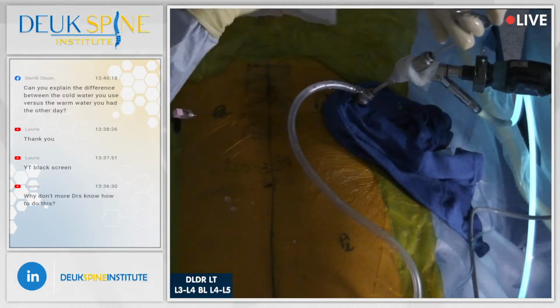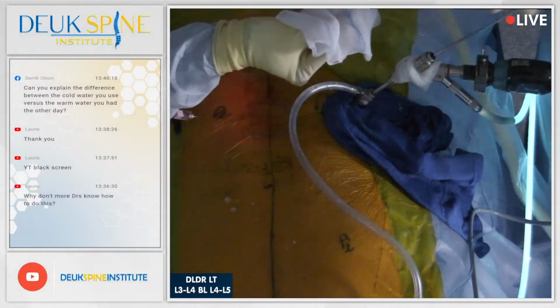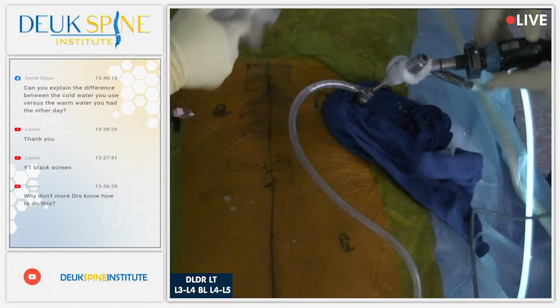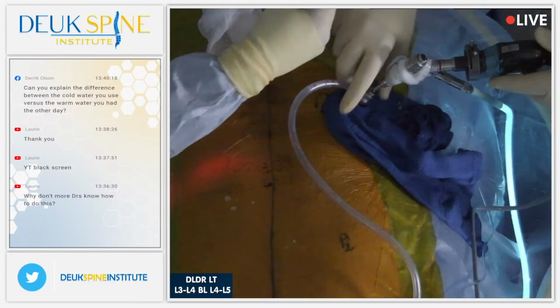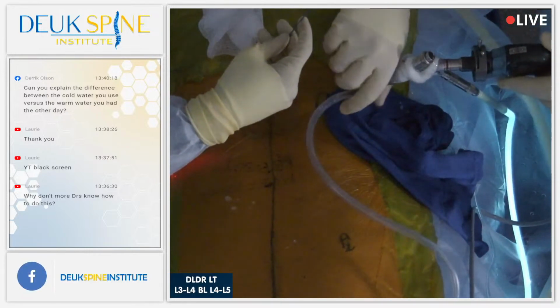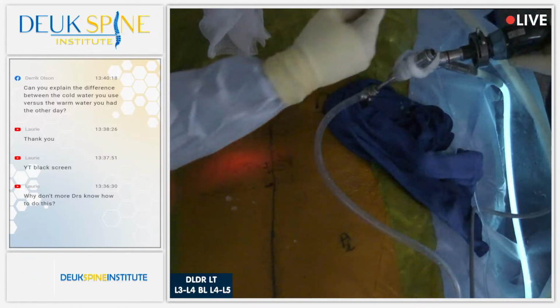If you don't do fusions and artificial discs, you're not considered sexy. You're not considered cutting edge. You're not considered a top surgeon. So there's this stigmata associated with surgeons about doing what the industry wants you to do. By the way, there's the tear right there we're fixing.